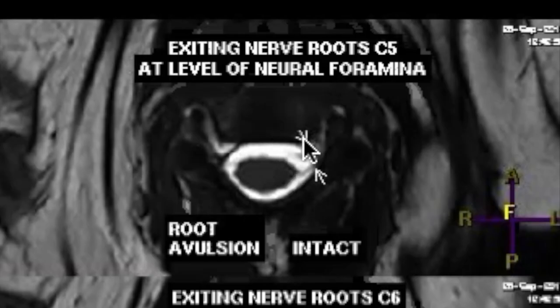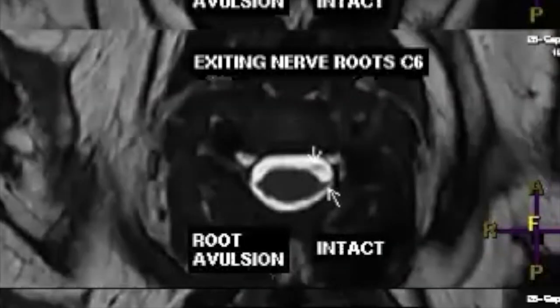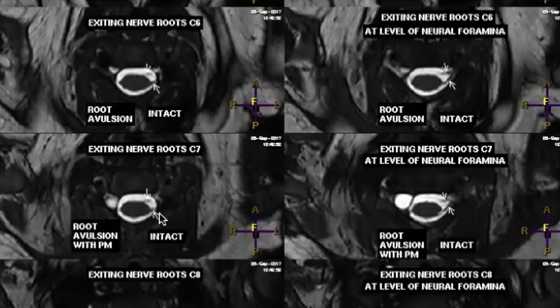Again same at the level of neural foramen, the C5 left-sided rootlets are seen, the right side root is not seen here. Same is the case at C6 level. At C7 level, same thing here.